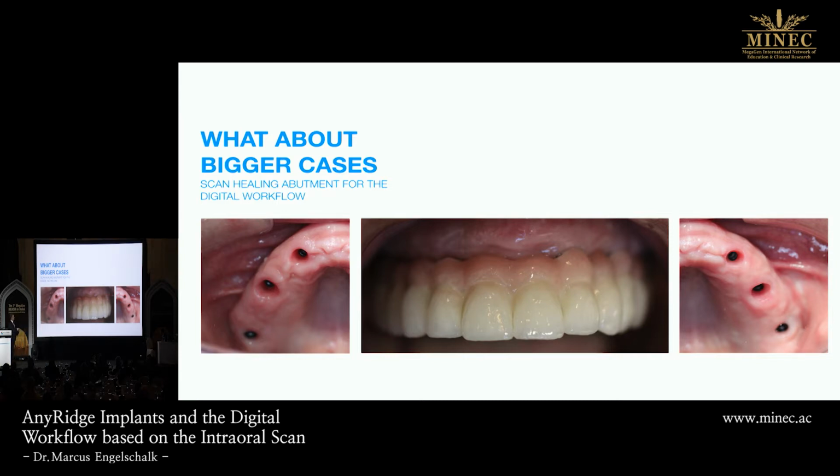And you see perfect healed situations. And then you can bring everything very easily based on the CAD/CAM system. It's easier for you to do the intraoral scan than to do an impression in these cases. And if you've done impressions in edentulous jaws on implants, screw it in, it's not a nice business.